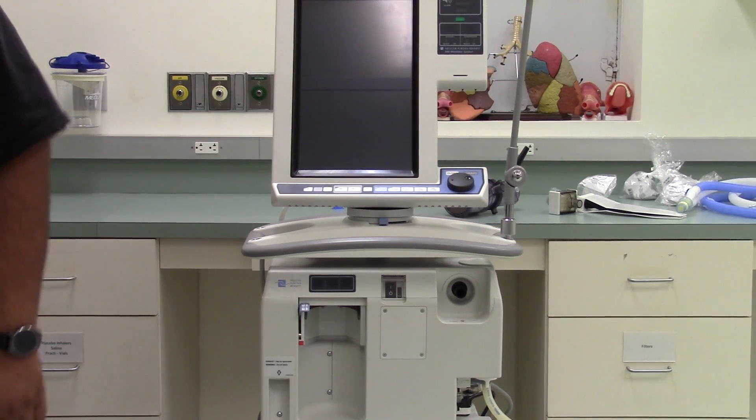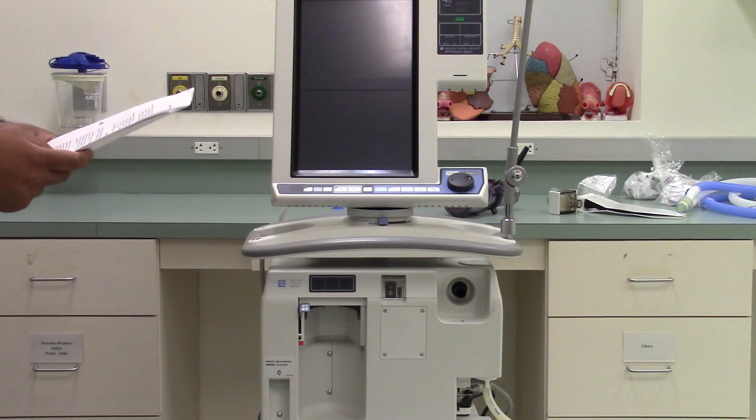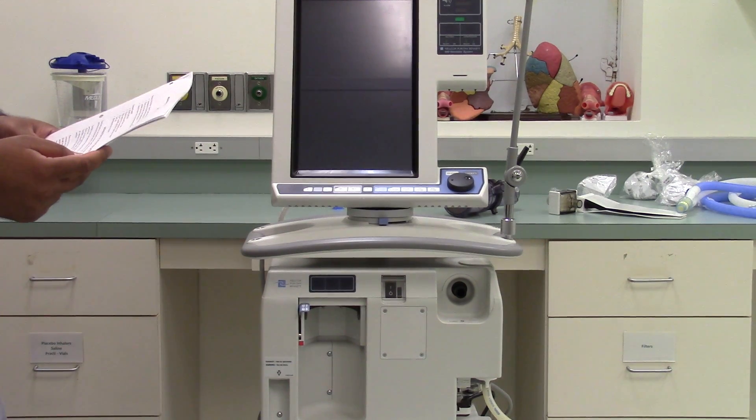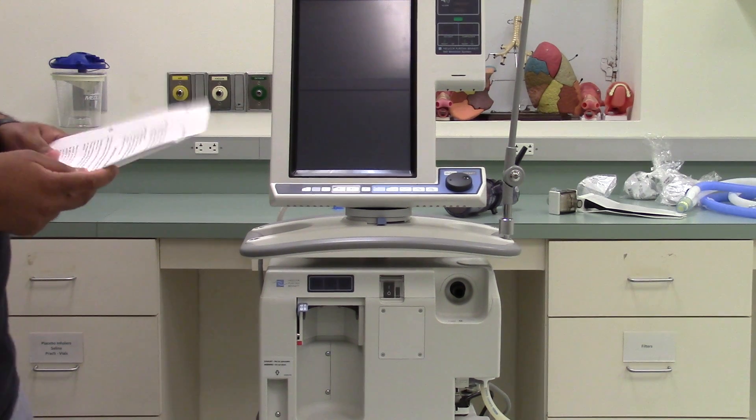This is a mechanical ventilation lab activity, PB 840, week 3. The purpose of this activity is an introduction to the PB 840 ventilator: place a circuit with a heat and moisture exchanger and Ballard inline closed system suction catheter on the PB 840, and describe how to turn on the ventilator and input settings.